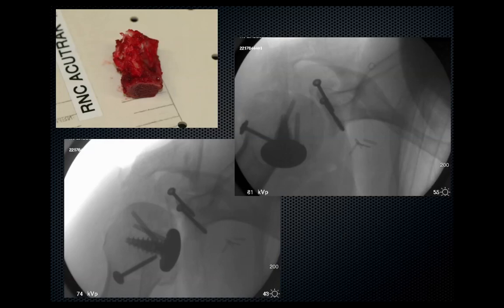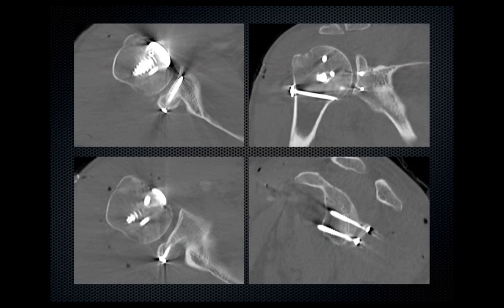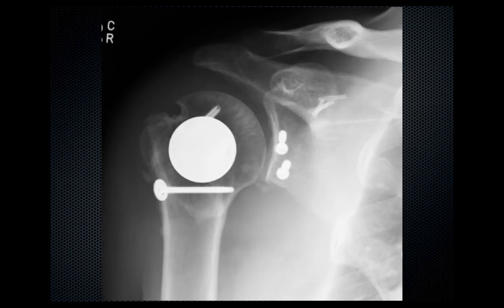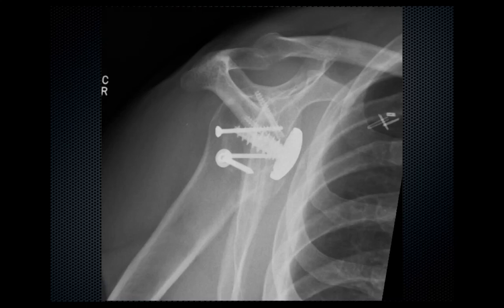In this particular patient, due to the severe soft tissue stripping of the posterior part of the glenoid, a second iliac crest graft was used to extend the radius of curvature of the glenoid. A parachute technique has been used to restore the greater tuberosity and superior cuff. These are post-operative CT scans and X-rays at 2 years. There is no loosening around the peg of the HemiCAP.